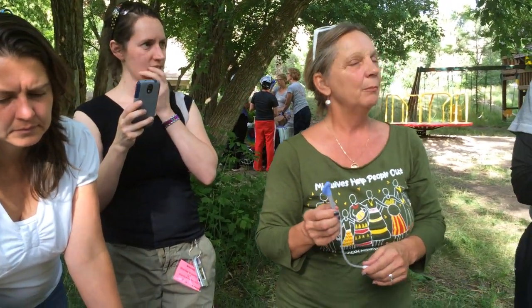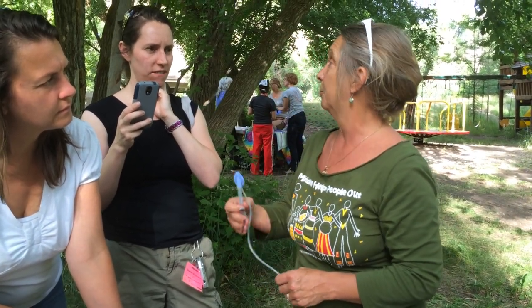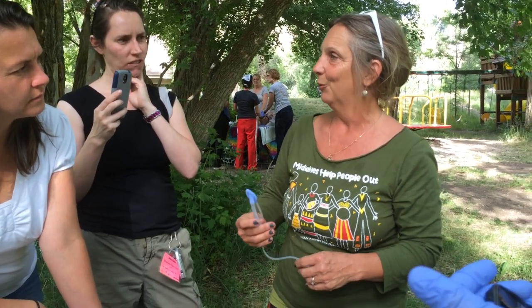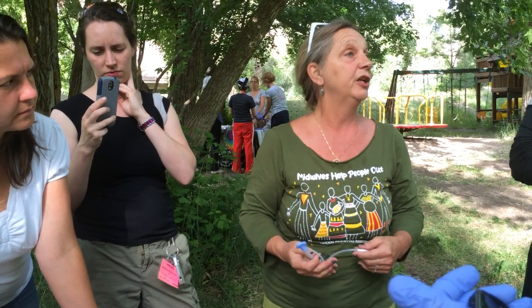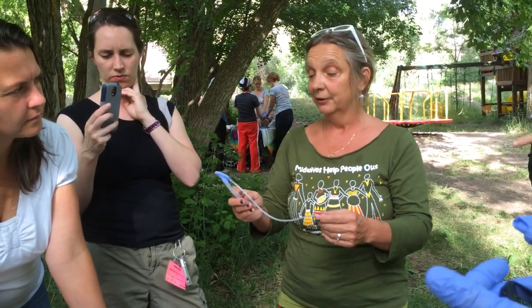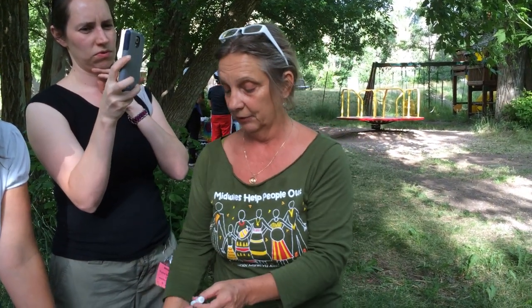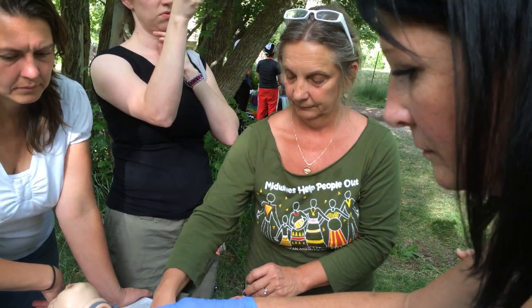Yeah, only one. Because a small one will keep air from going in the baby's stomach, even if it's a bigger baby. But a bigger one won't go in a smaller baby. So only carry the one that's most effective. Hopefully you don't use it too often, right? And you can label your bag, especially if you're going to carry two different sizes. Because otherwise you're sitting there in the heat of the moment going, 1, 1.5, what was I supposed to do?